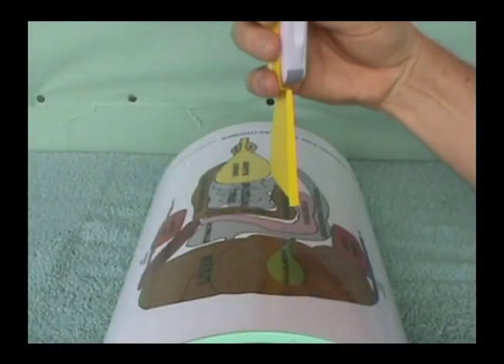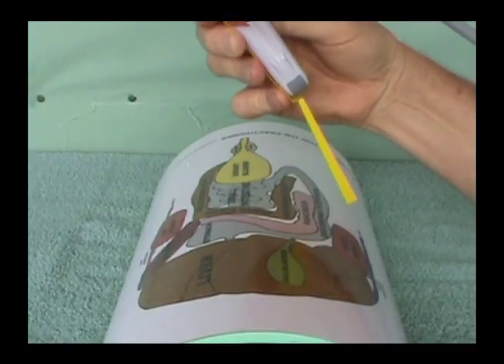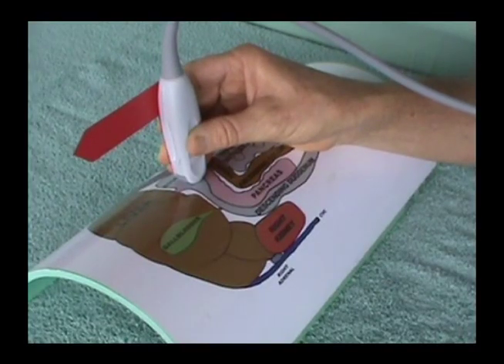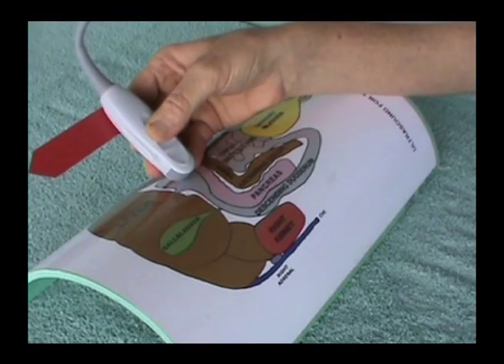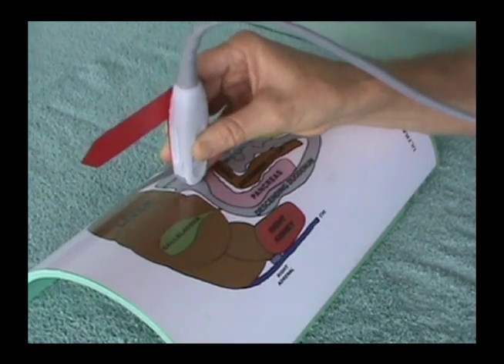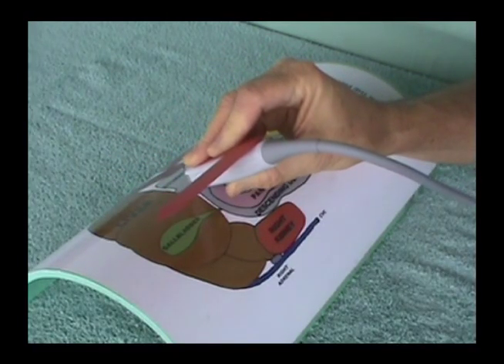Fanning is a side-to-side movement of the transducer from a point of fixation. The transducer's point of contact on the patient's body does not change. In a sagittal position over the stomach, you can fan to the patient's right side. Note that it is the ultrasound beam that is moving to the patient's right. You can also reverse the direction and fan to the patient's left side.